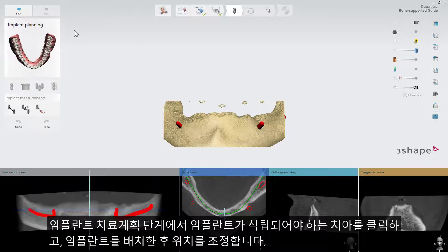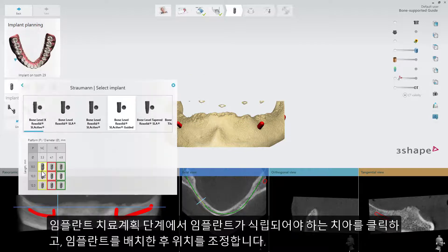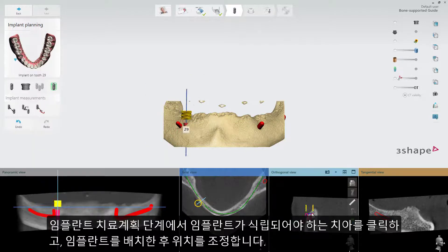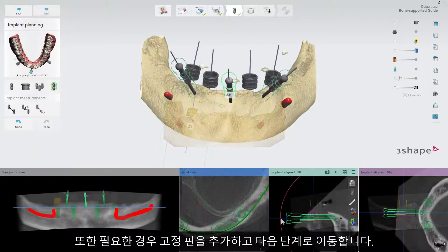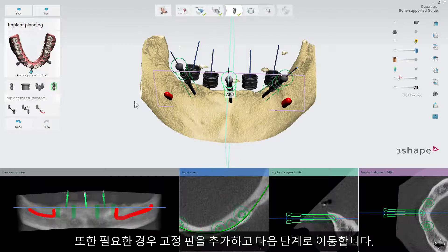In the Implant Planning step, select the teeth where the implants should be placed. Place them and adjust their position. Add anchor pins if needed and move to the next step.